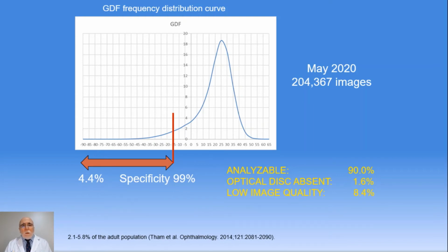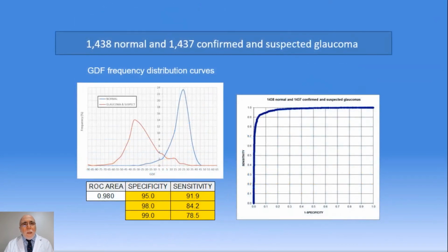If we add those suspected of glaucoma to this percentage, the frequency will be slightly higher than 2.1 and 5.8% of the adult population, which is admitted for glaucoma, but we must take into account that patients suspected or previously diagnosed are most likely to accept to participate in this type of works. In the case of the images included in the platform of the company RetinaLyze, we do not know the final diagnosis of the cases that were referred to the health systems for diagnostic verification, but we can make an indirect verification by observing if the results coincide with what we have observed in our reference cases.